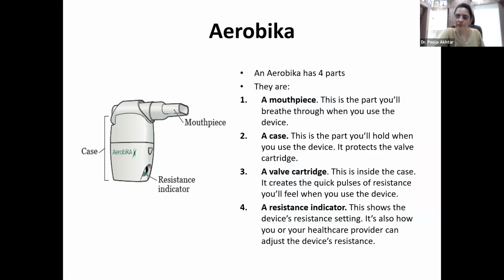to begin with, and we have to achieve it 10 to 20 times. And when the patient blows, the patient is encouraged to stop the blowing. For example, he blew 10 times and then he feels like coughing. So encourage your subject after the first cycle to do a huff maneuver and try to remove the secretions into the sputum mug. This can be done after every cycle.